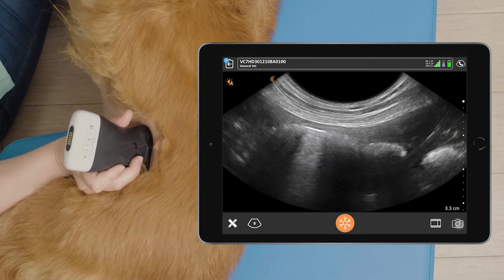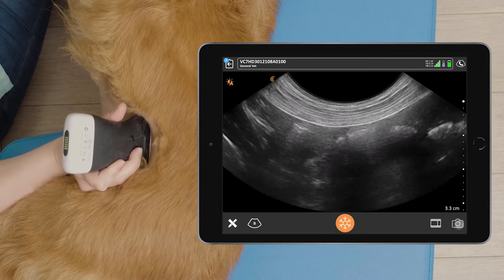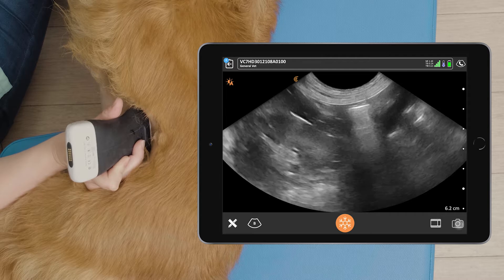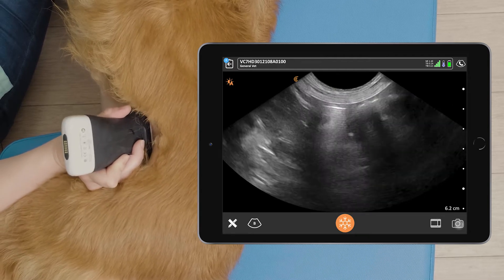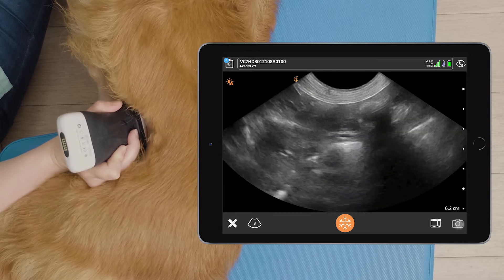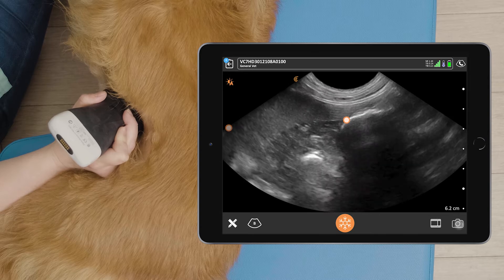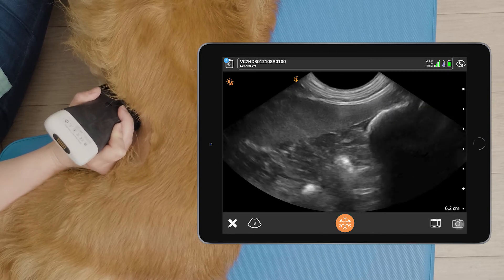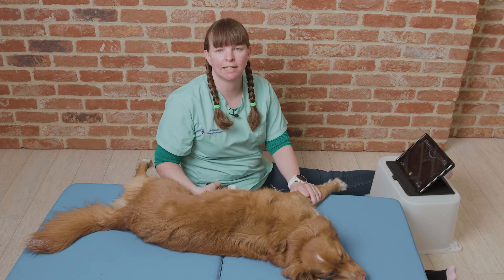We can reduce our depth and we can see how thin the colon wall is. We can follow this structure cranially until we get to the transverse colon at about the level of the kidney and the spleen, where it becomes the transverse colon. And that's how to scan the descending colon.